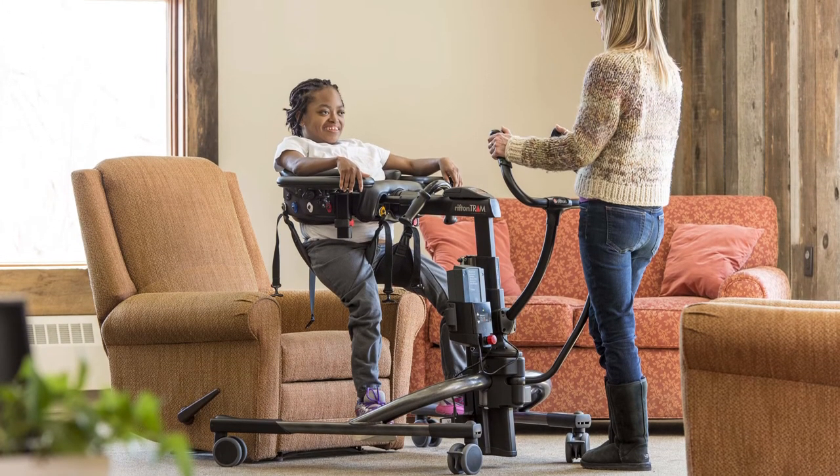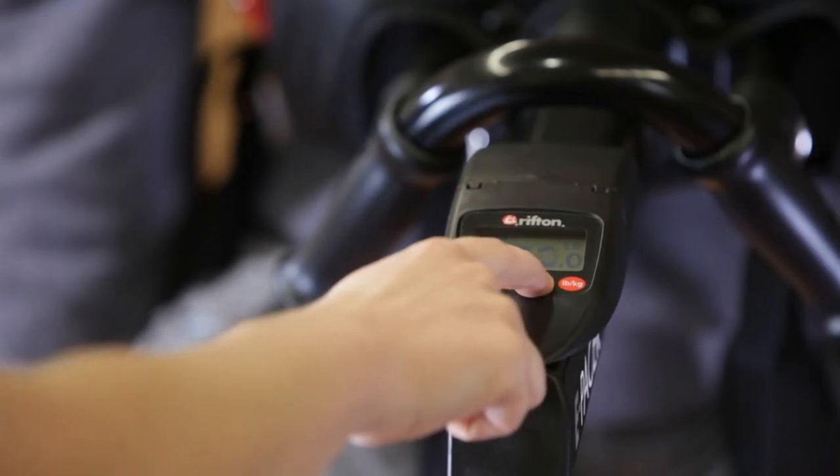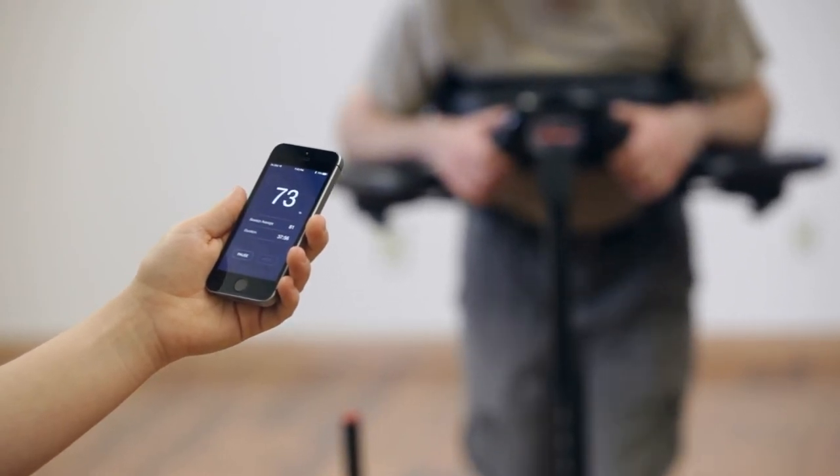To measure weight bearing, lift the client until the tram or ePacer is supporting all their weight and zero the scale. Then begin gait training. Gate Tracker will now display the weight the client is bearing.